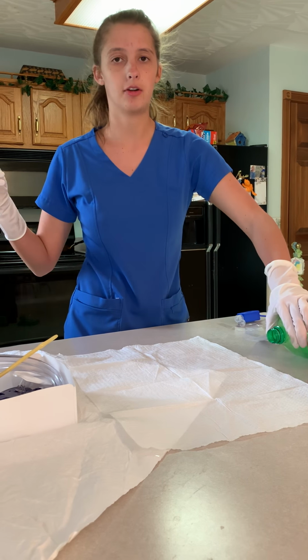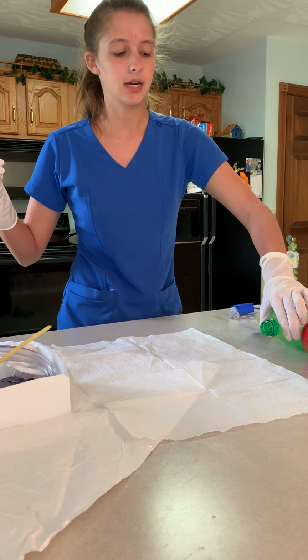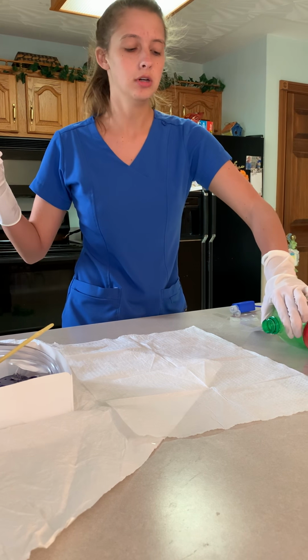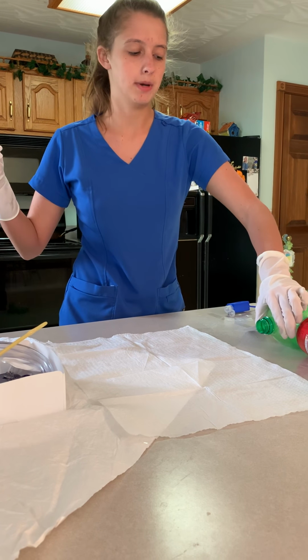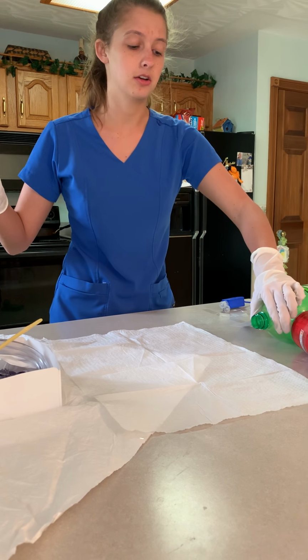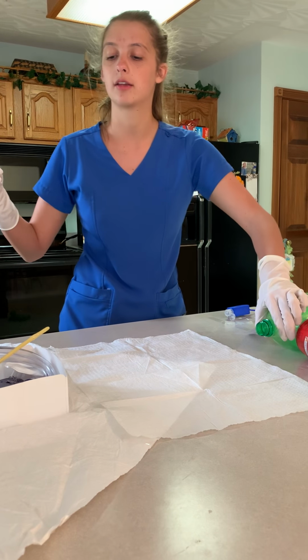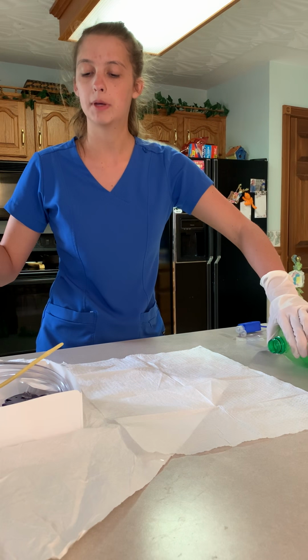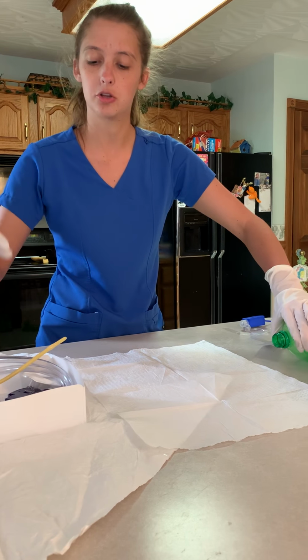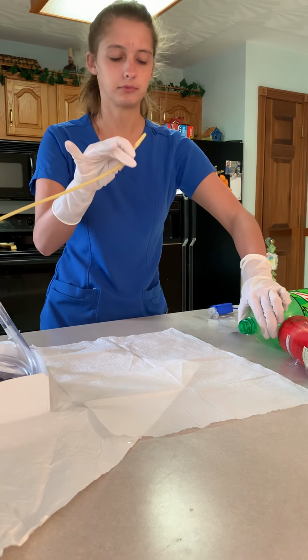So I will be inserting the catheter into the urethral meatus. And again, I'm keeping my hand at a 90-degree angle. And I'm going to instruct the patient to take a deep breath as I do this. And again, the foreskin is still retracted if we have an uncircumcised male patient. So I'm going to pick up my catheter, and I'm going to make sure I don't go back more than 2 inches from the catheter.